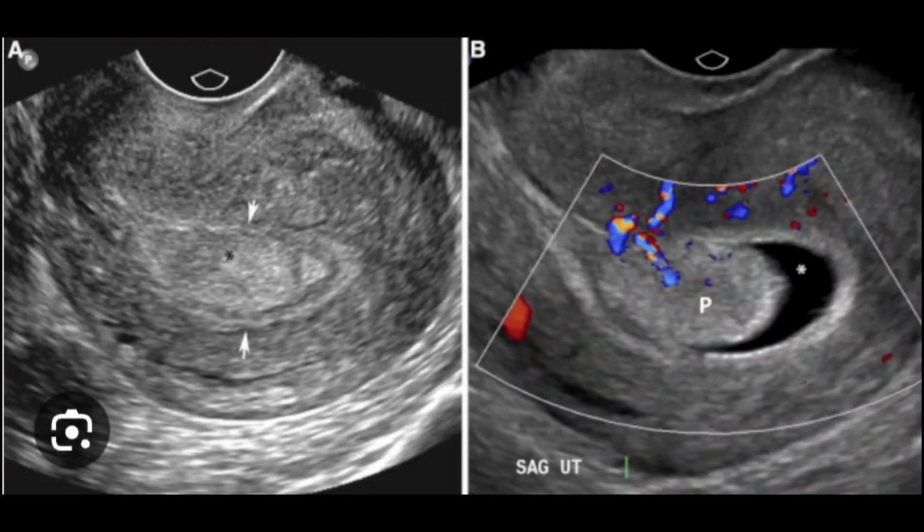Well, I would not be very happy with this scan, because this starts ringing bells because of certain differentials in my mind here. In that case, because of the vascularity to the endometrium, and particularly the endometrial focal bulge protruding into the cavity surrounded by a small amount of fluid within it, it may give rise to suspicion of endometrial carcinoma on top.